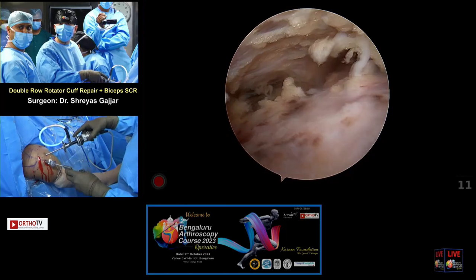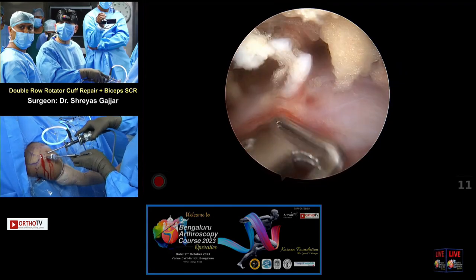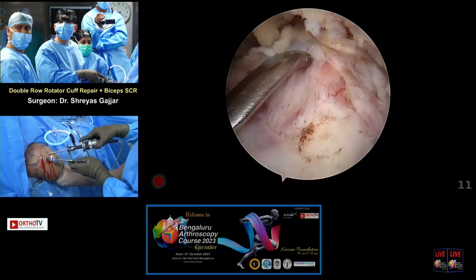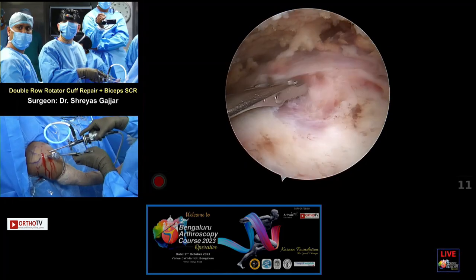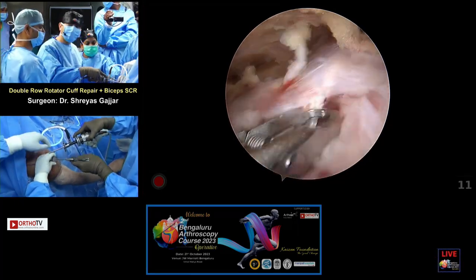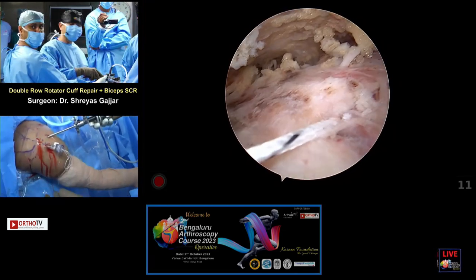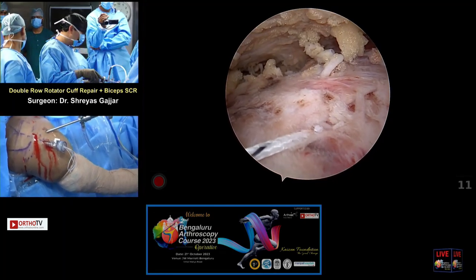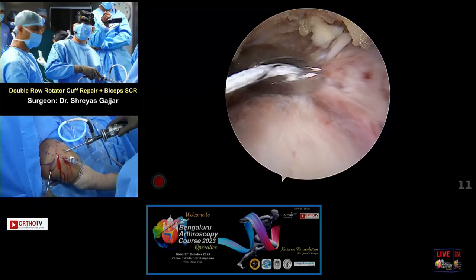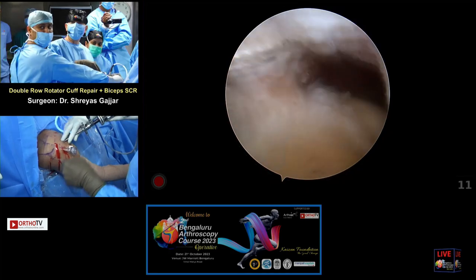And on the cuff side, we need to be just 2 millimeters lateral to the musculotendinous junction. I'm just trying to figure that out, and I will be 2 millimeters lateral to it. Okay, can you hold the cannula, please, Akshay? Yeah, good. Now, one second. Can I have the suture retriever, please? From my posterior portal, I will retrieve the tapes for better suture management. As you can see, hold your camera, please. Good.